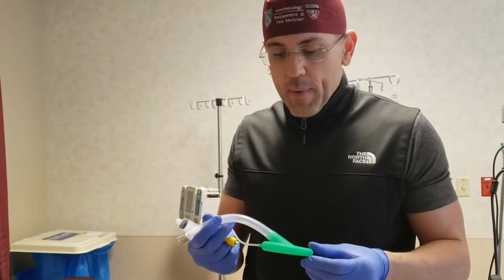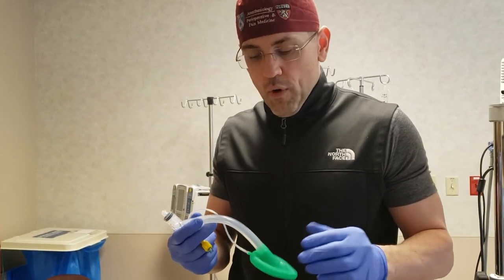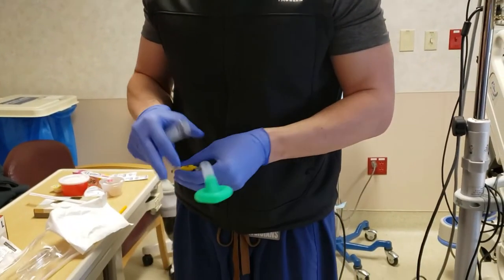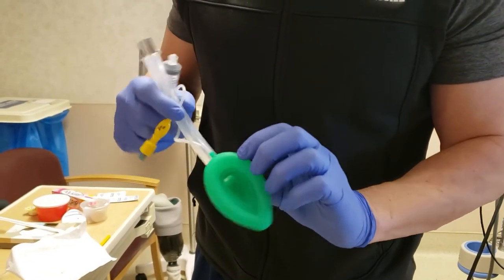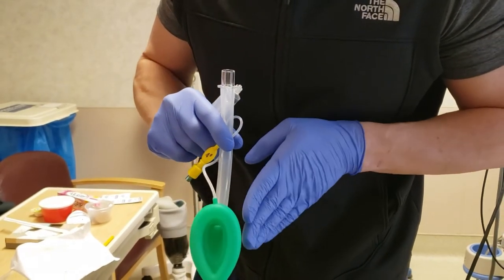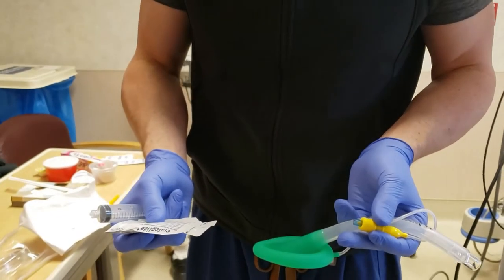We're going to be placing an LMA in a gentleman. In men, we usually put a size 4 or 5; in females, usually a size 3 or 4. What I usually do is put the LMA in while it's inflated, so I'll go ahead and put a little air in — nice and firm. Note that this particular LMA does not have any bars going across it. This is important because we're going to have a bronchoscope go through it, so it'll be easier not to have any impediments through this opening. We also have a little lubrication to put the LMA in as well.